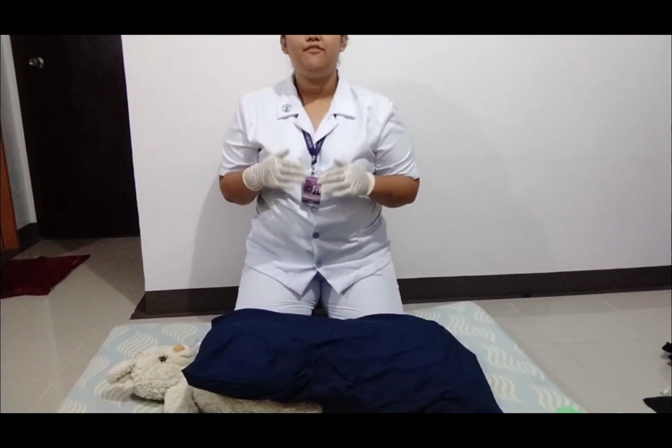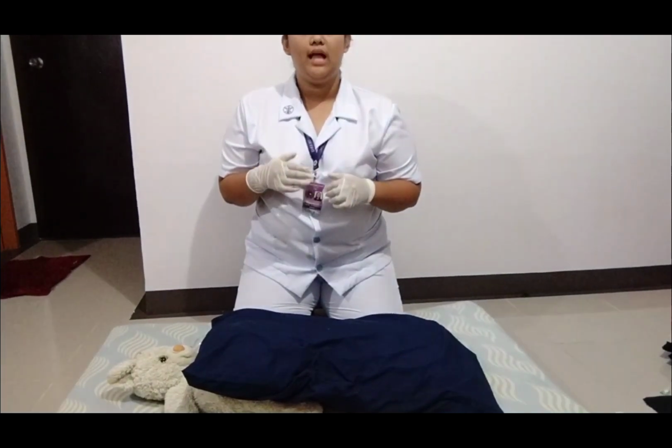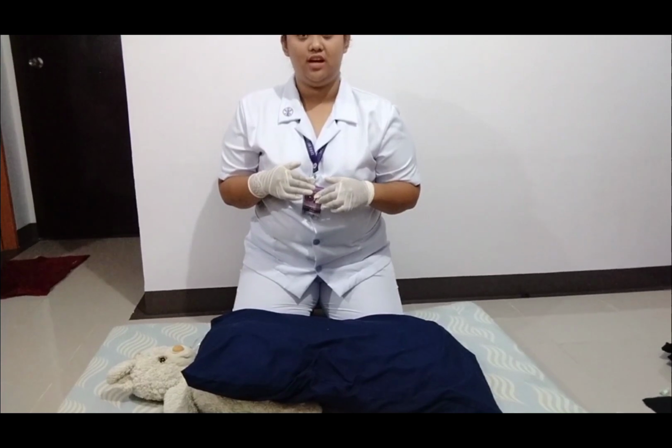After doing that, we'll have to wait for the rescue responders, and then after doing everything of the procedure, we'll have to document the procedure done.